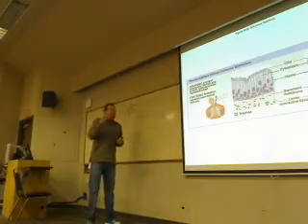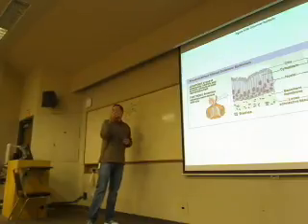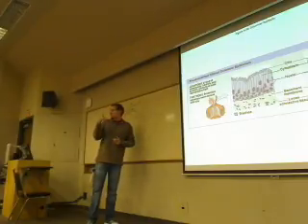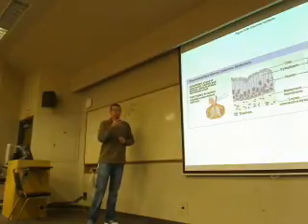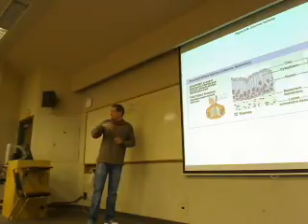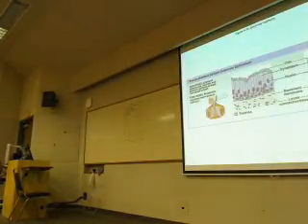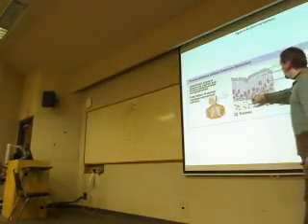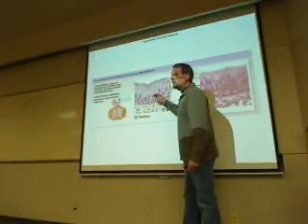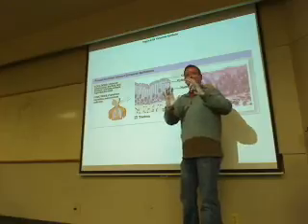So this is an example of a simple tissue. By definition, a simple tissue has to have one layer, and all the cells that you're seeing in this picture are attached to a common basement membrane, and the cells are not stacked on top of each other. What happens in this particular tissue, pseudostratified ciliated columnar epithelium, is that it is so compacted and so dense that these cells are pushing and squeezing on each other like crazy.